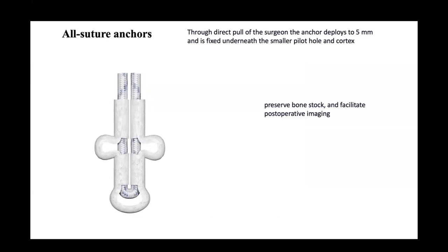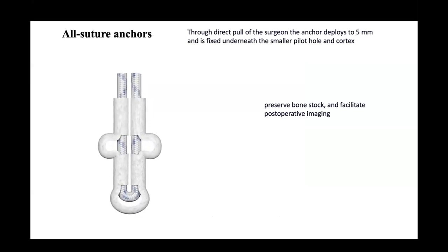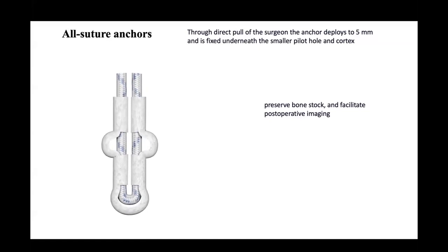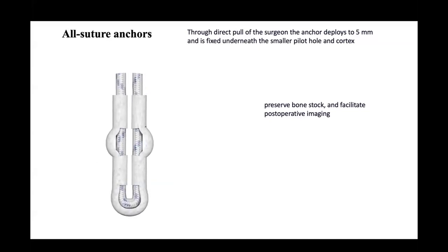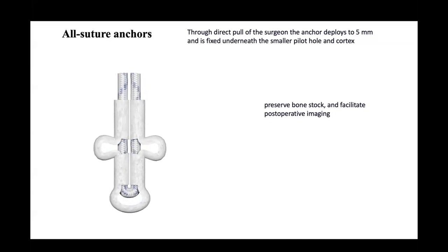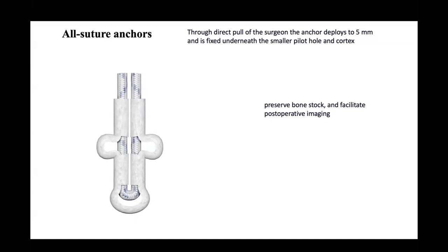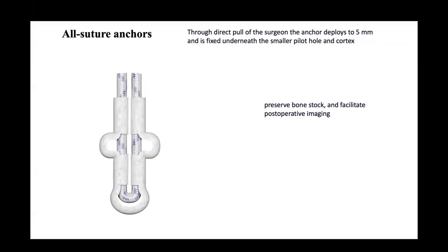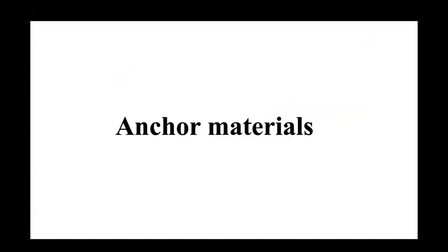The advantage of all-suture anchors is that they come in very small sizes, and the pullout strength is also very good. It is fully biodegradable, and it can be used in labral surgeries and places where there should be multiple fixation points and the size of the anchor should be low. This preserves bone stock, and post-operative imaging is also very easy.